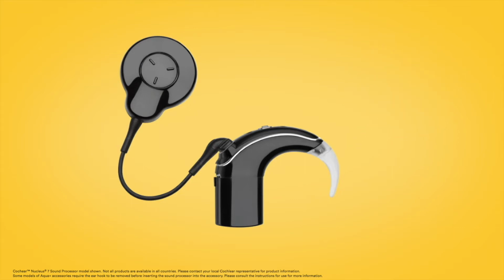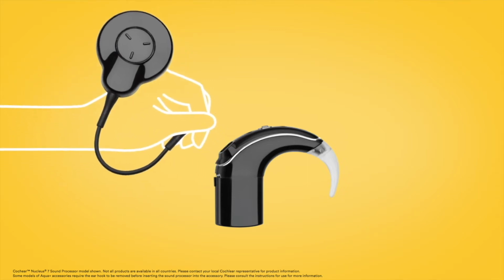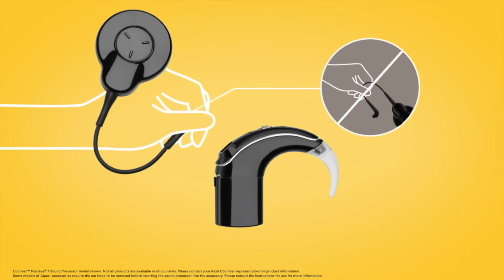To use Aqua Plus, first, carefully unplug your usual coil from the sound processor by holding the coil cable grip and firmly pulling it straight out of the sound processor. Be careful not to pull on or twist the coil.